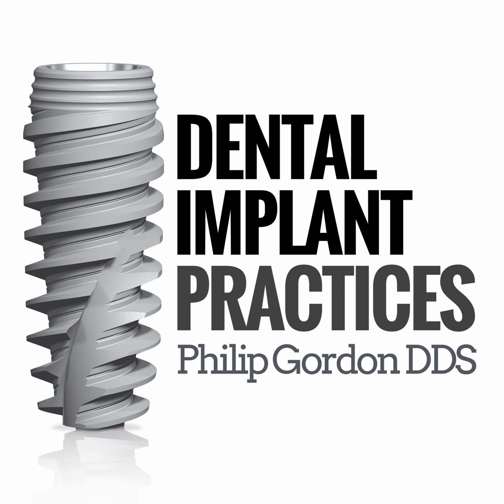While that's happening, and this is something that we have that's really tricky, is our clear duplicate protocol. So at the time of surgery, you are going to pick up 2 bridges. The patient's long-term provisional, which is a monolithic PMMA milled bridge with a titanium reinforced bar. You're also going to pick up the clear bridge with an identical copy of the patient's prosthesis. Same exact thing. You're just going to do it twice.